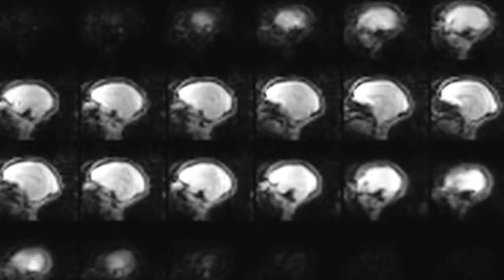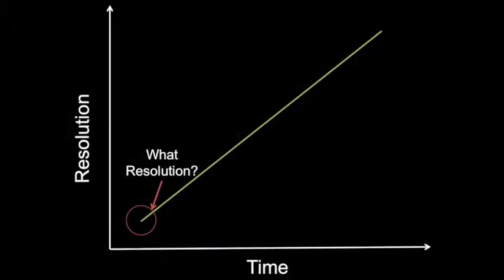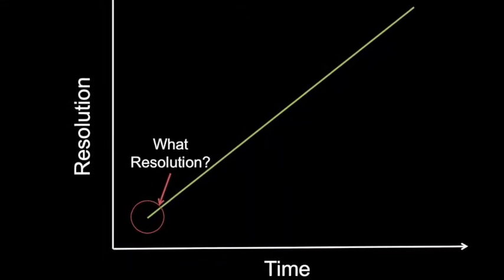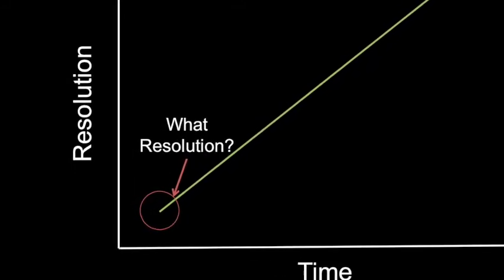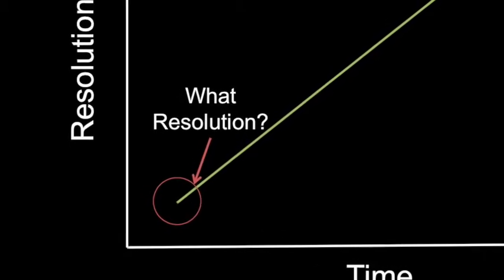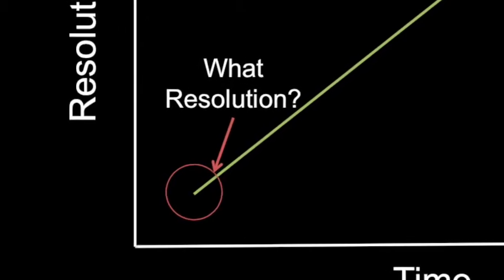These volumes are acquired by a navigator, which is also a scanning mechanism that can come in simultaneously with an MRI scan and acquire fast but low resolution and noisy volumes. During the acquisition, there is a trade-off between time and resolution. We want to acquire these volumes in the shortest possible time interval because movement increases as time interval increases, which means that we need to get the lowest possible resolution to achieve high accuracy.